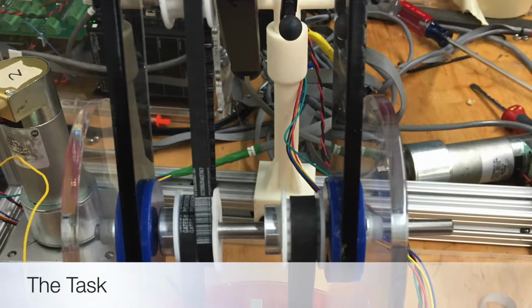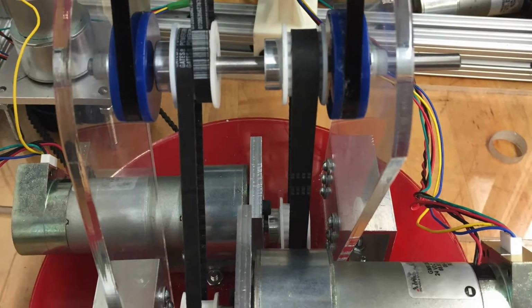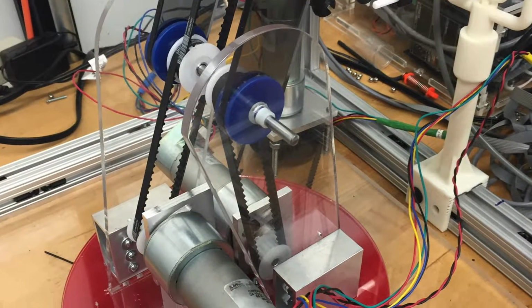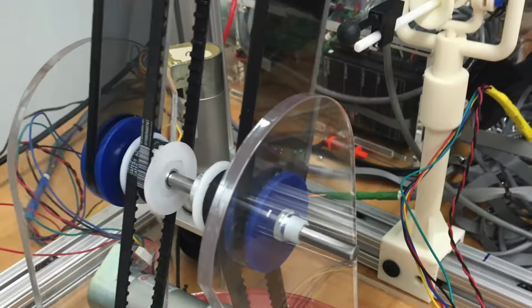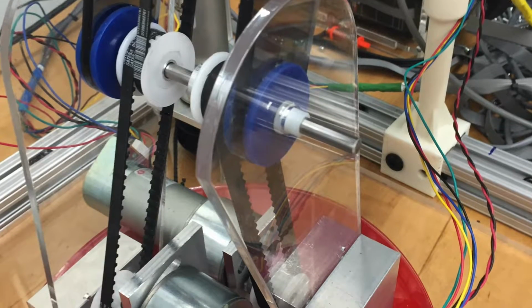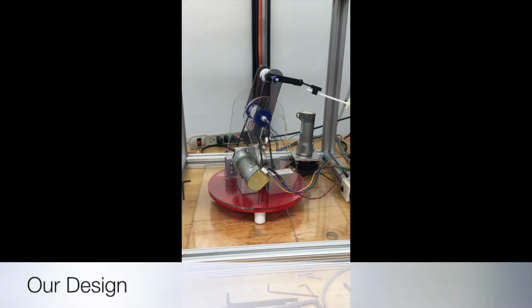For this project, we were tasked with designing and building a machine that actuates a tool to perform arthroscopic or endoscopic surgery. The machine was required to move in 3 separate paths: C1, C2, and C3. C1 and C2 simulate inserting and extracting a needle respectively, and C3 demonstrates independent motion in the X, Y, and Z directions. Our machine was modeled after a robot arm.